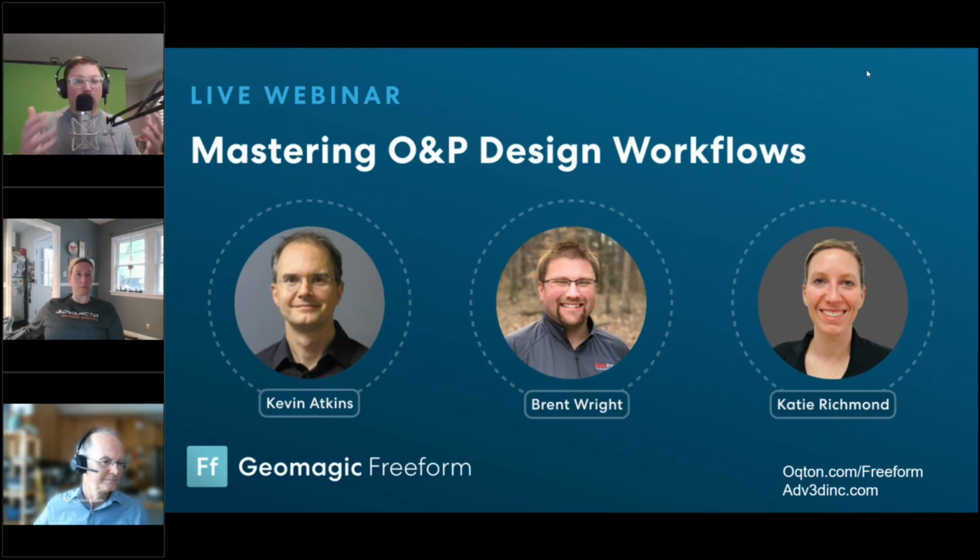Now, we're also looking into how do you lightweight that? There's more steps to go, but my encouragement is you do the analysis on your model, and then you also do a physical analysis to make sure those talk to each other well, and then be consistent on making your prostheses in those specific ways. Is that a fair assessment?